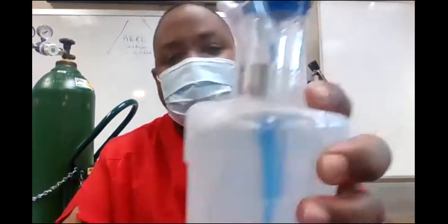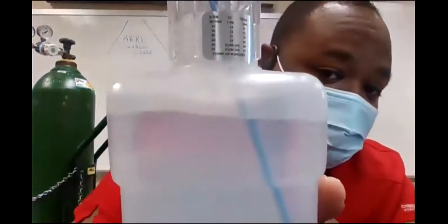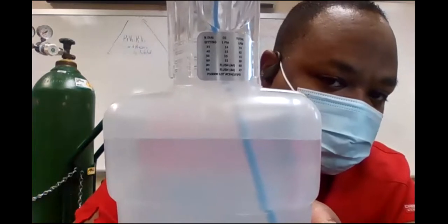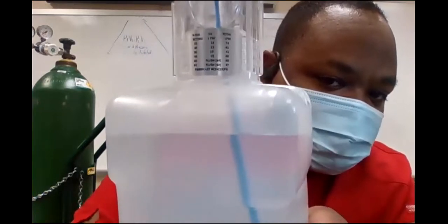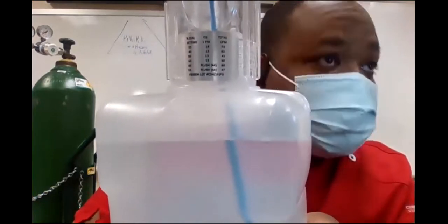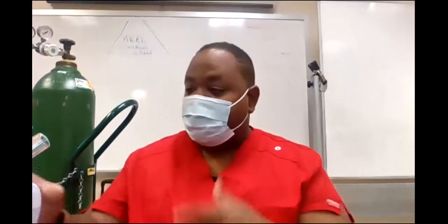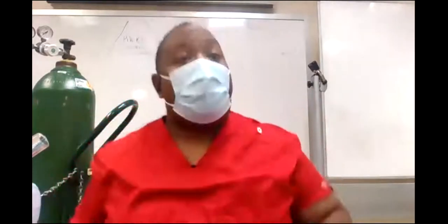Look at the top line. I don't know if you can see it or not, but the top line says if you want them on 35%, you put the O2 liters on 14 and you get a total flow of 74 liters per minute. So if you work that out yourself in the magic box and you put 35% at 14 liters per minute, you're going to get a total flow of 74. They tell you that, or if they don't have that, you know how to figure it out.